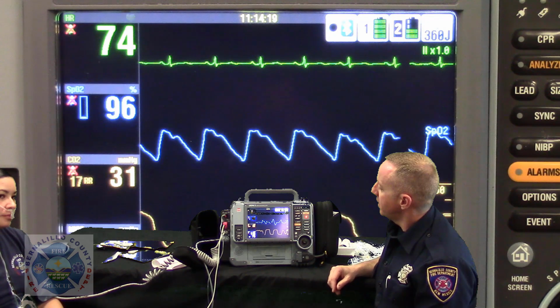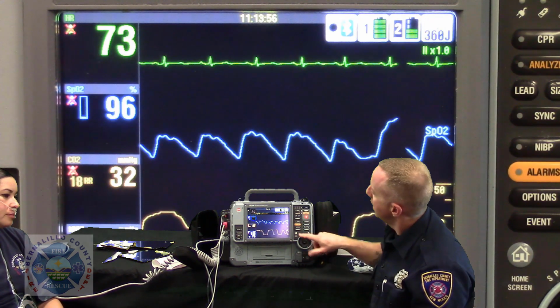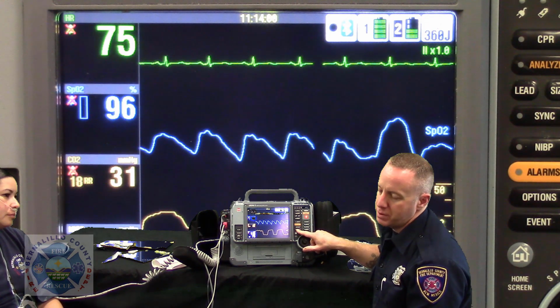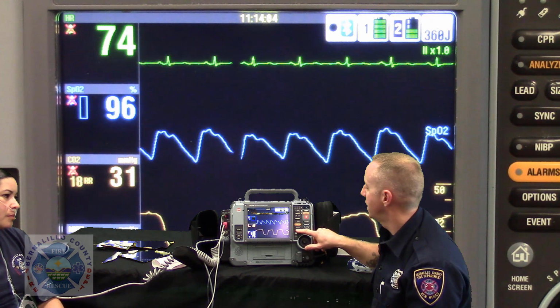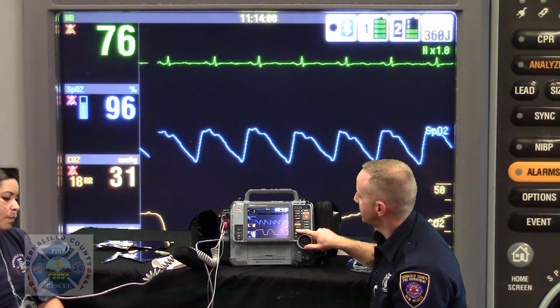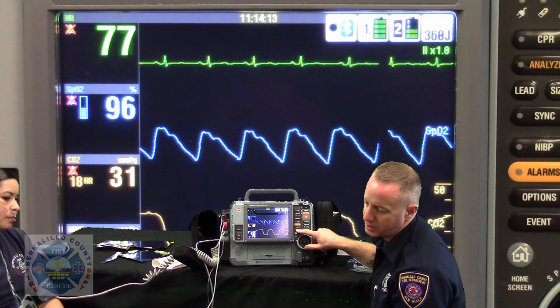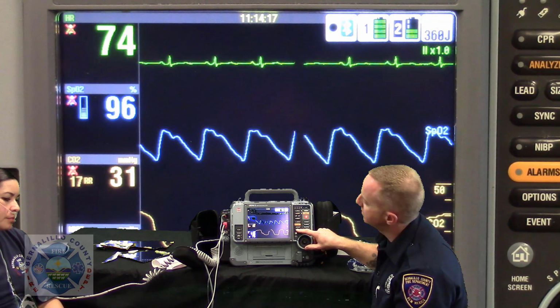Another great thing about the LifePak 15 is that the most common interventions that you're going to make are listed in the events section. So rather than having to look at one person's watch or a timer or figure out when we gave an intervention, we can go ahead and timestamp it here. So for the case of showing off the features, we'll just work this as a normal typical chest pain call, because that's got a lot of interventions involved.